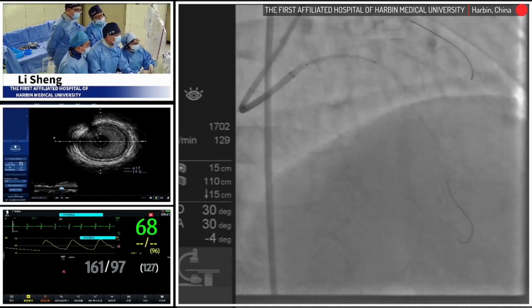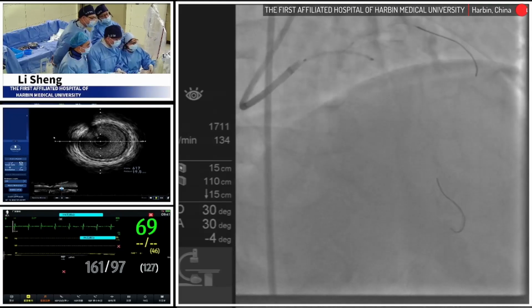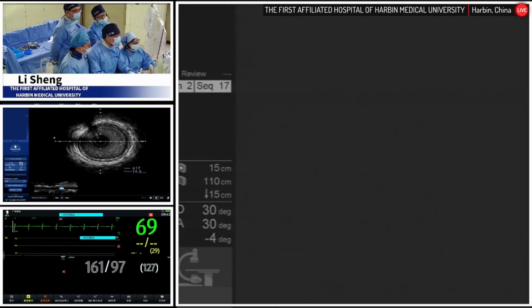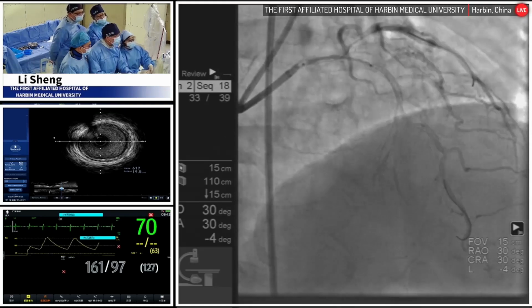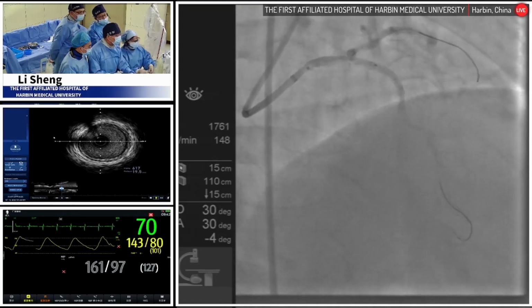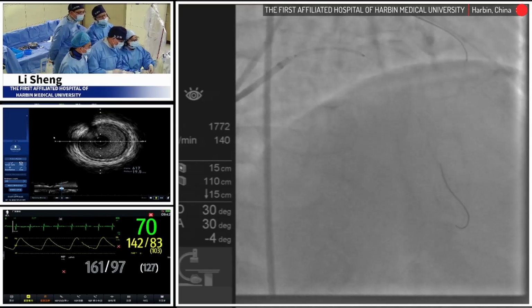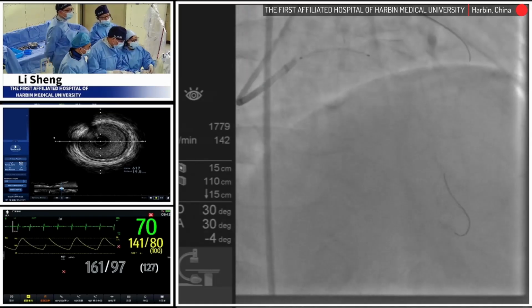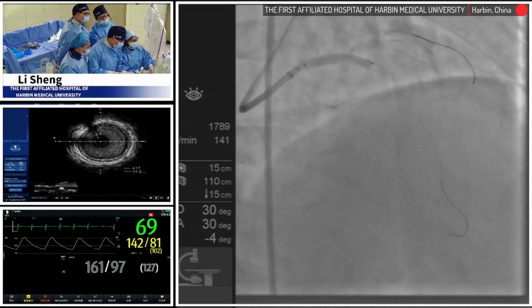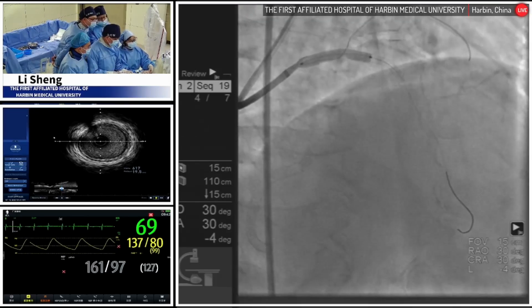More test. Okay. It's good. Deployed. Okay. Done.